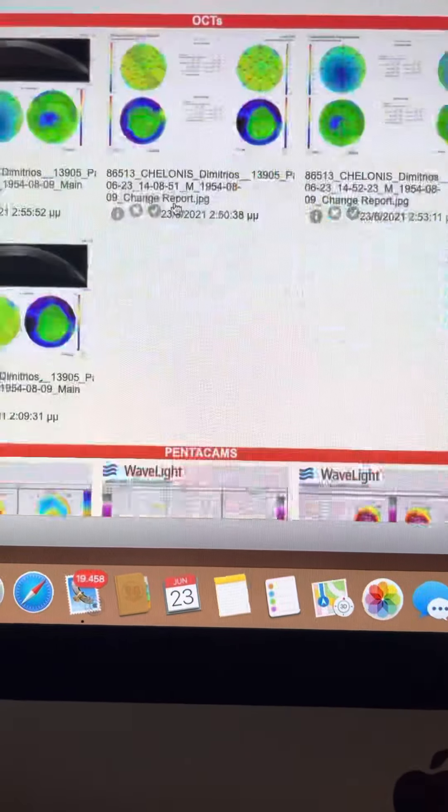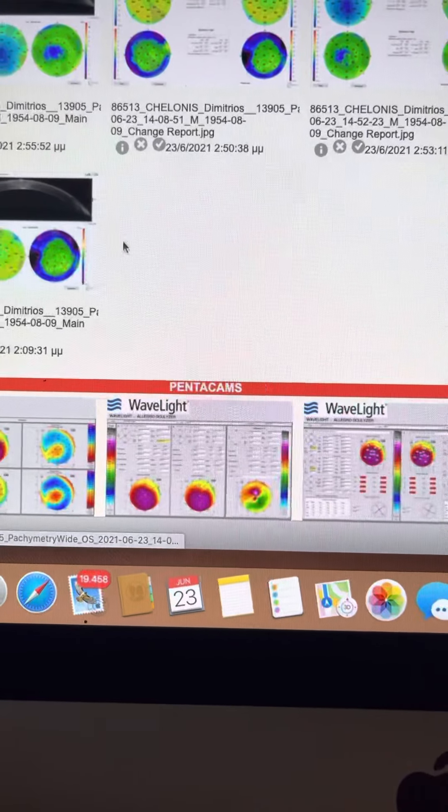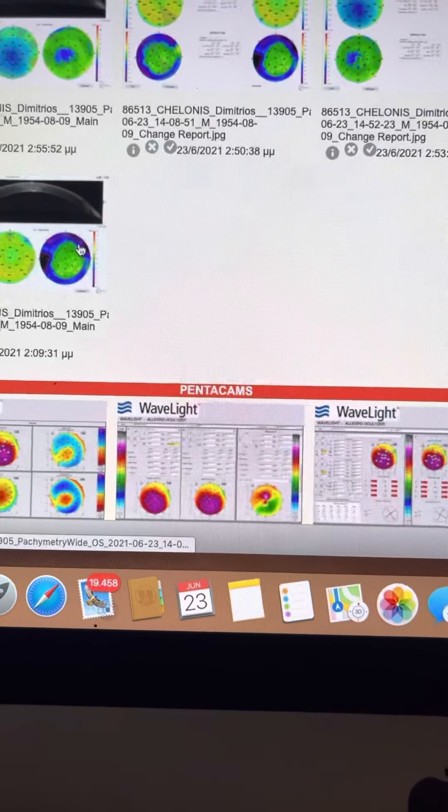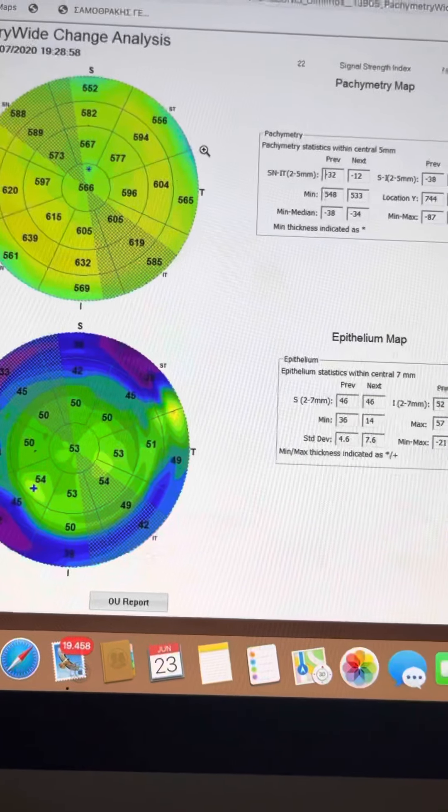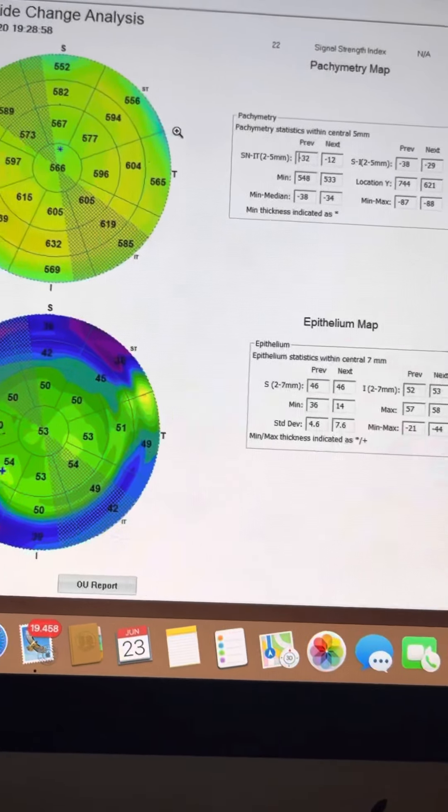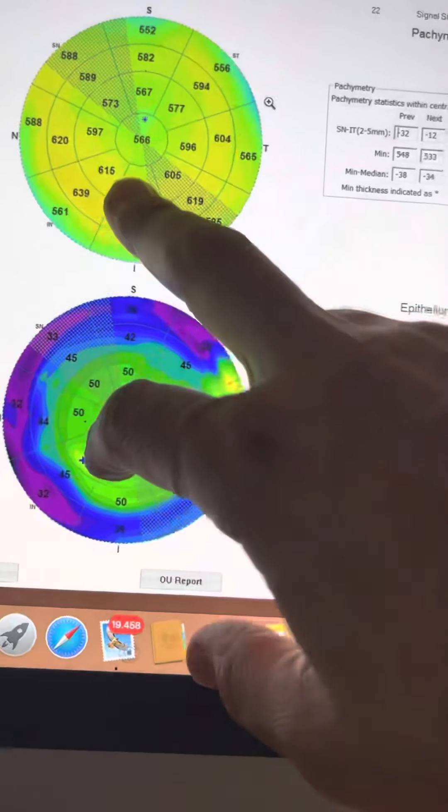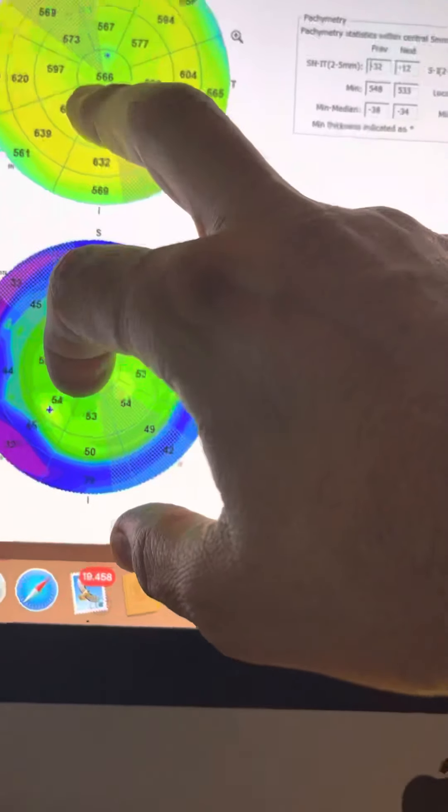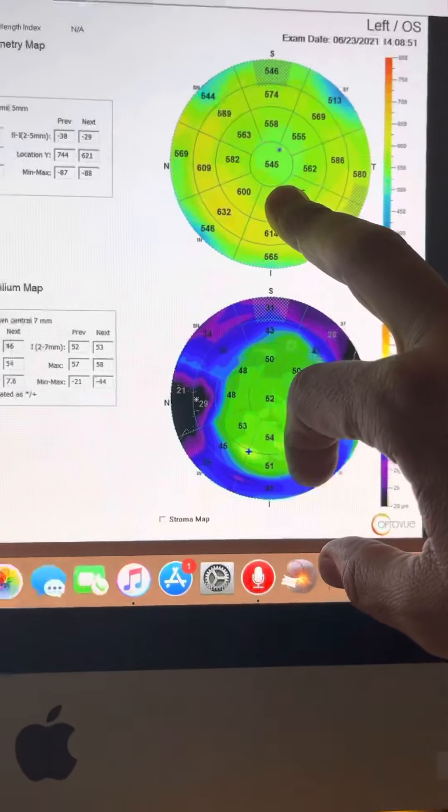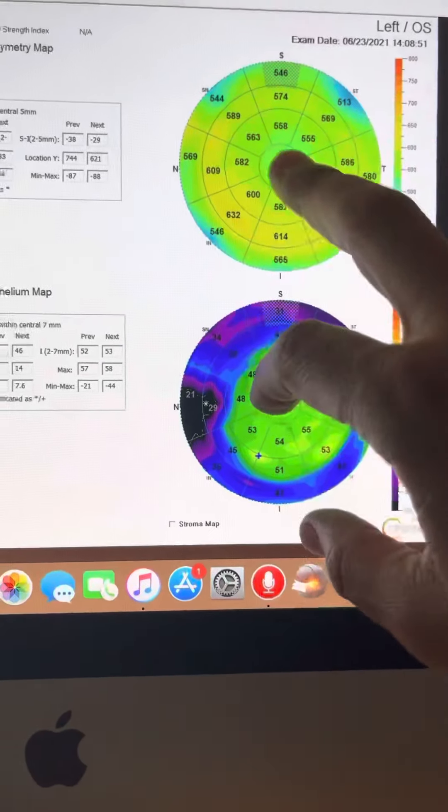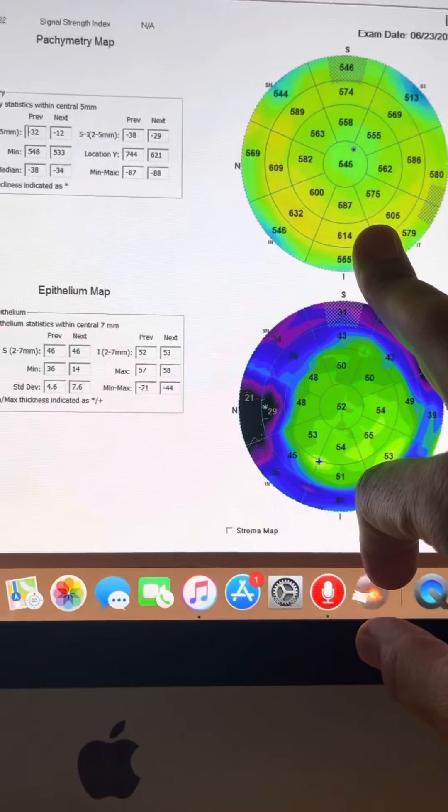The left eye now that has the cornea transplant, again, we're very much interested here on the cornea thickness. It was 566, it's 545.